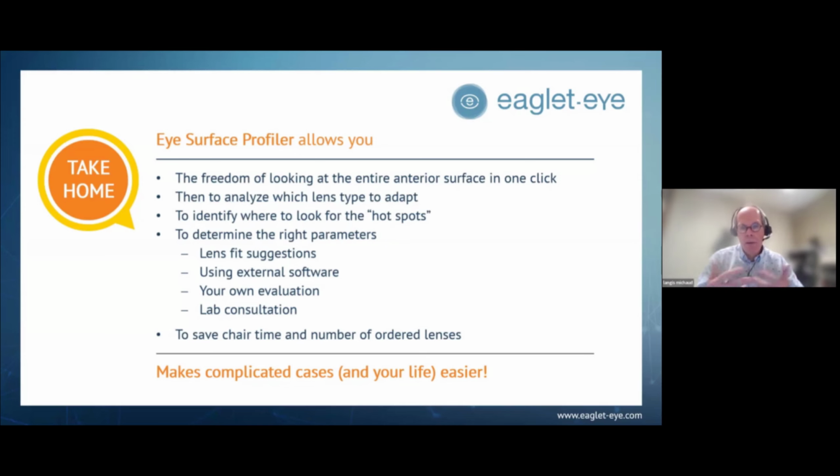It doesn't preclude your own evaluation under the slit lamp, of course, and doesn't preclude also consulting the lab consultant, as I mentioned, but you can certainly have the best of both worlds, meaning you have a lot of information to share with the consultant. Because if you just take the phone and call the lab and say, hey, by the way, I have this patient that does something, you have no imagery, no photos, no fluorescein pattern, no maps to work with, the poor consultant at the other end of the phone just guesses, as you would guess in your own mind.